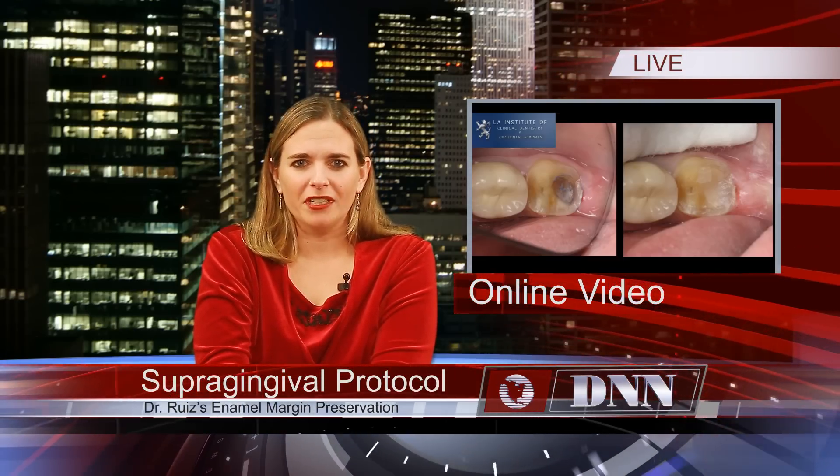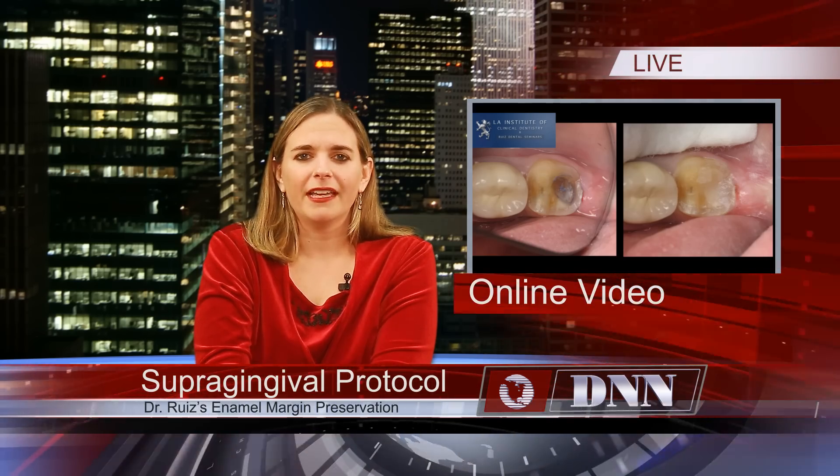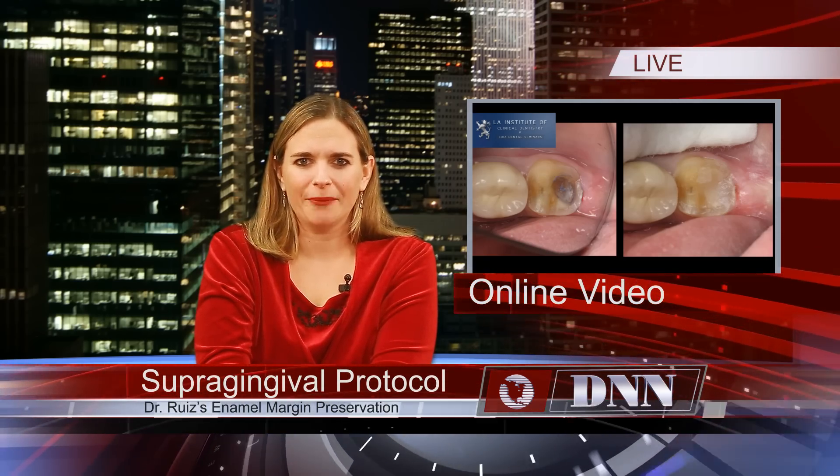Dr. Jose Luis Ruiz of Burbank, California, discusses and demonstrates a supergingival protocol: the enamel margin preservation technique. Let's take a look.